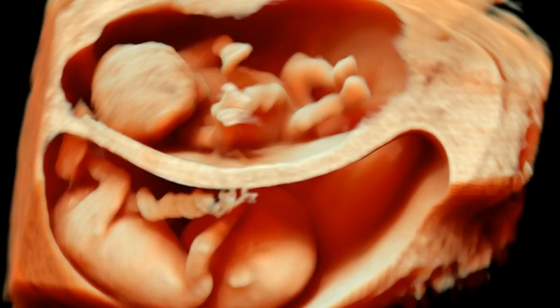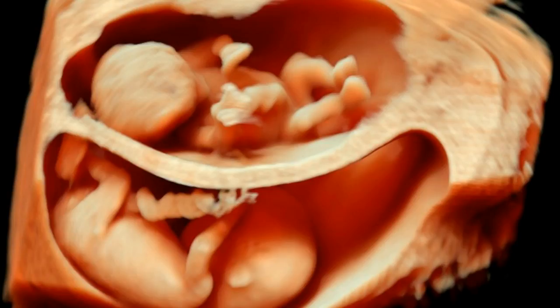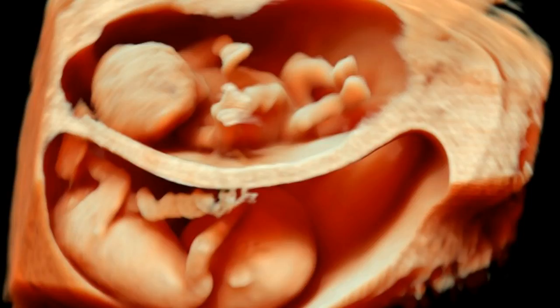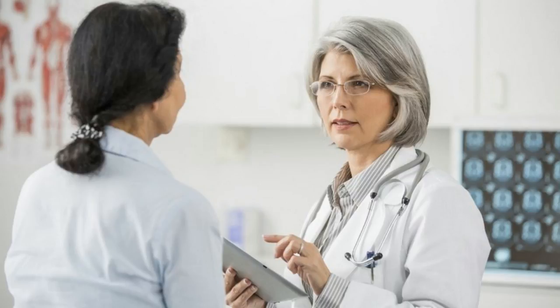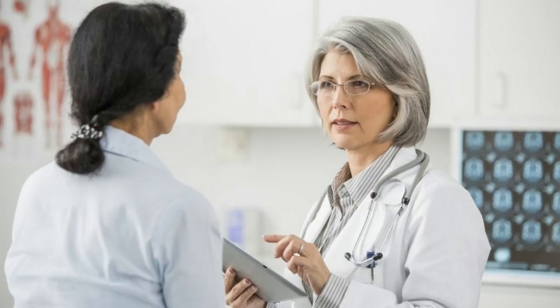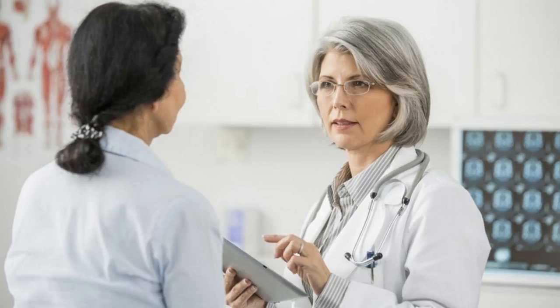While the traditional 2D technique is more common, having been around for more than 25 years, recent advancements have allowed images to be viewed in 3D and even 4D. 2D, as the name signifies, was two-dimensional, which means you could view flat-looking images like normal photos. It helped in diagnosing heart defects and problems with other organs such as kidneys and lungs. 2D images are flat and in black and white.